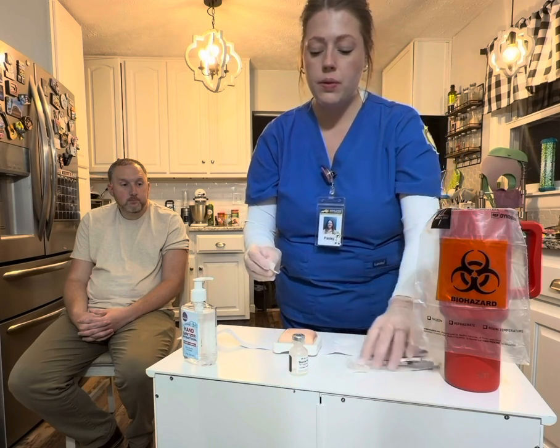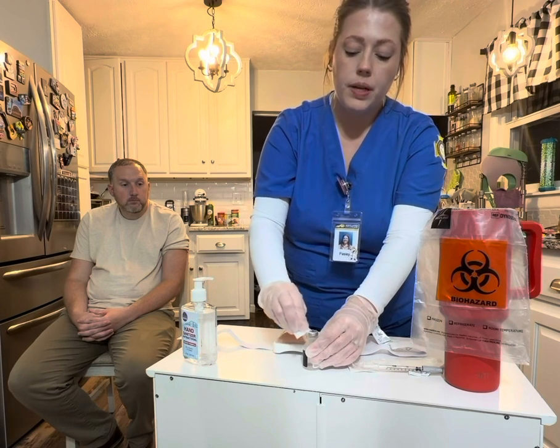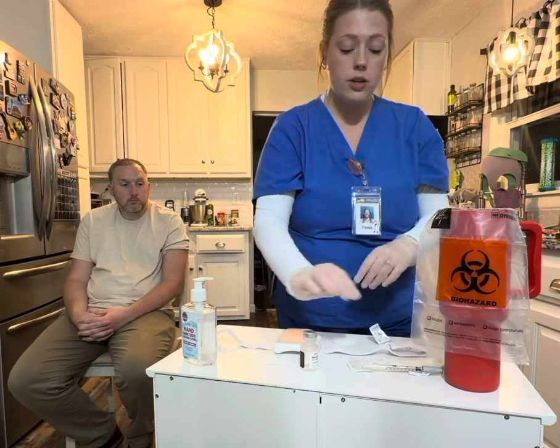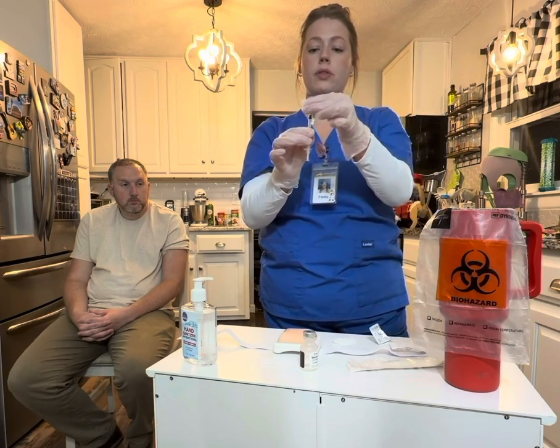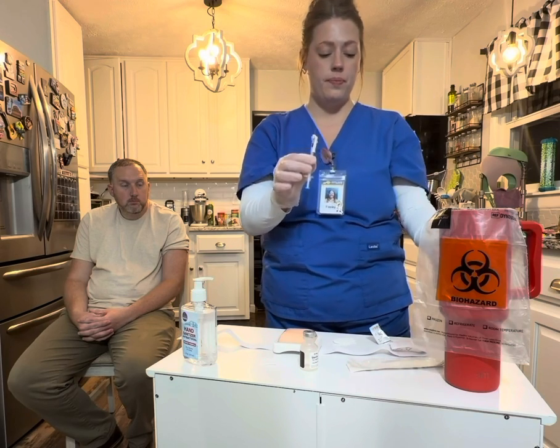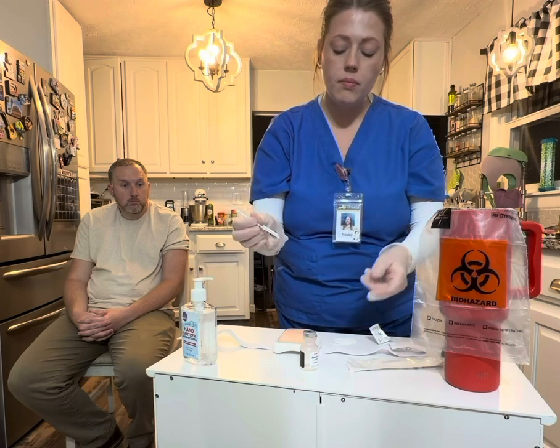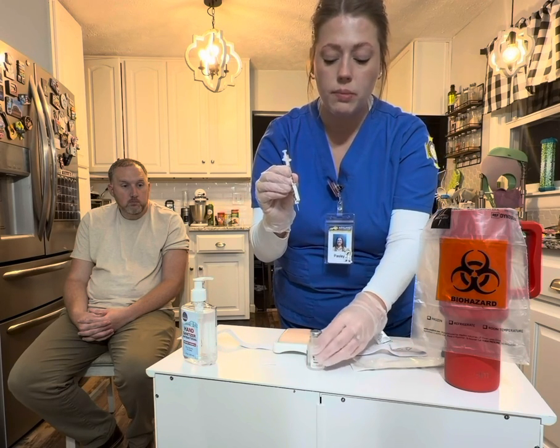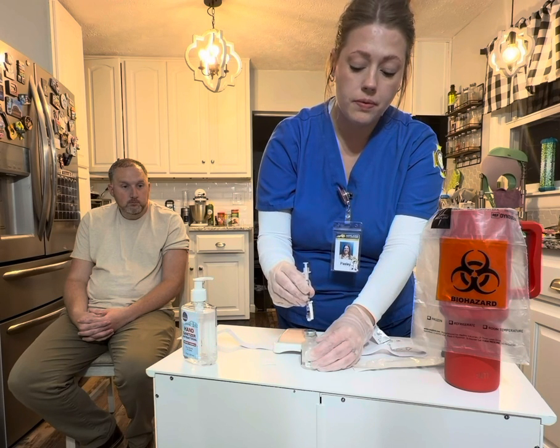So what I'm going to do is go ahead and clean the top of my vial in a circular motion. And then I'm going to allow that to air dry. So then holding my syringe in my dominant hand, I'm going to uncap it. And then what I'm going to do is I'm going to hold on to my vial, and then I'm going to go straight in the center.